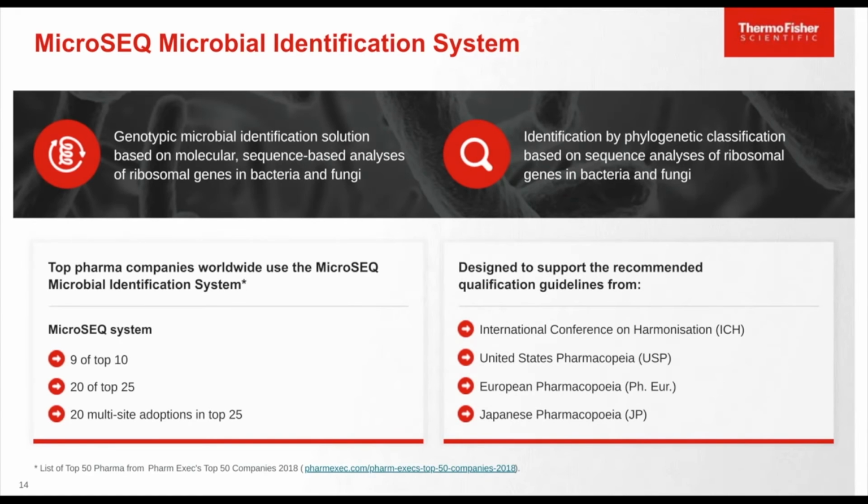Now, in terms of microbial identification, MicroSEQ ID in particular is a genotypic method based on the sequence analysis of ribosomal genes in bacteria and fungi.